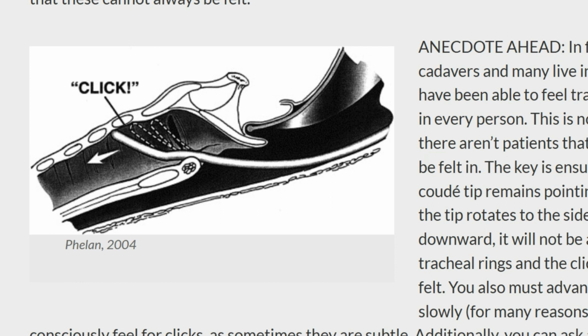The next important trick is using the click sound that you get. When you enter the vocal cords and enter the trachea, the shape of the bougie is such that it touches the anterior part of the trachea, and you can actually feel a click. Or you can tell your colleague to keep their hand there and they can feel that the bougie is going through. After that, when you thread the tube also, you can feel that it is going in the right direction. In 3A situations where you can't see the entry of the bougie into the vocal cords, you can directly confirm in this way.